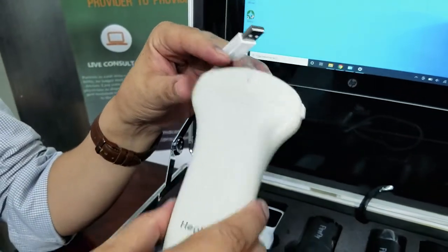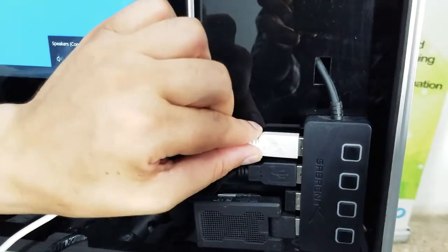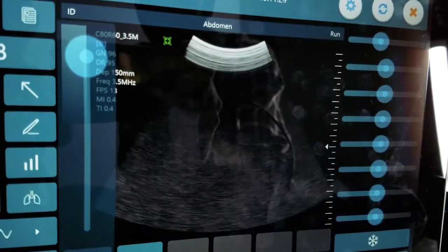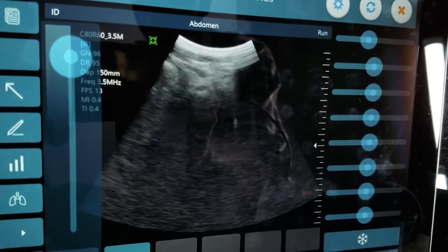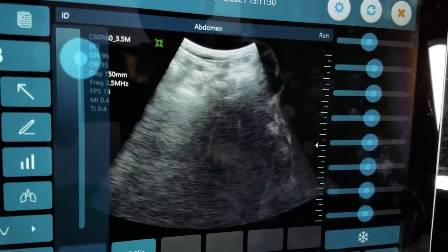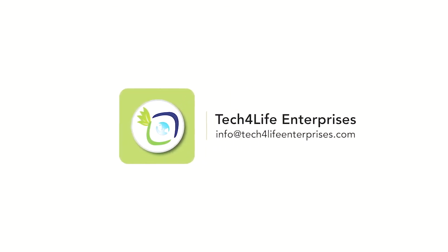Ultrasound is also connected the same way. The probe has a USB cable that can be connected to the USB hub, and the software is turned on on the tablet. The ultrasound image is shown on the screen, which can be shared with the physician through the screen sharing function.